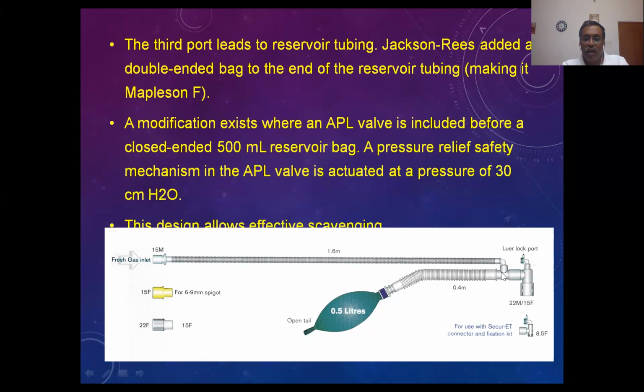And next, the expiratory pause. In the expiratory pause there is no air movement from the patient. It lasts very few seconds, roughly about 0.5 seconds, I think. Here the fresh gas flow will not get inside the patient. The fresh gas flow is directed to the expiratory limb and washes out all the expired air present in the expiratory limb. This is the most important thing.